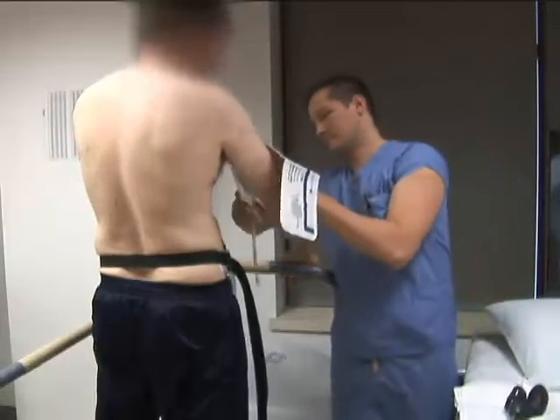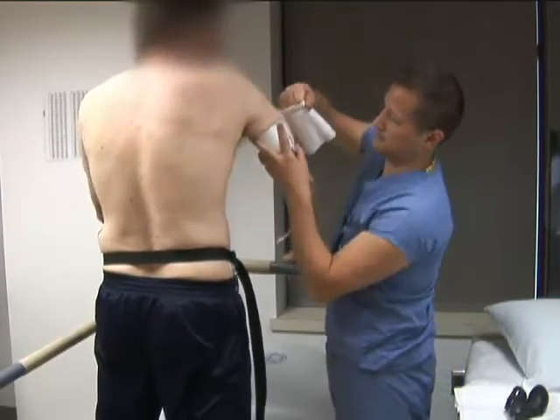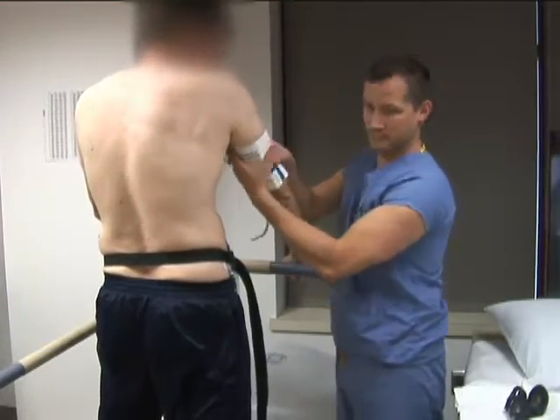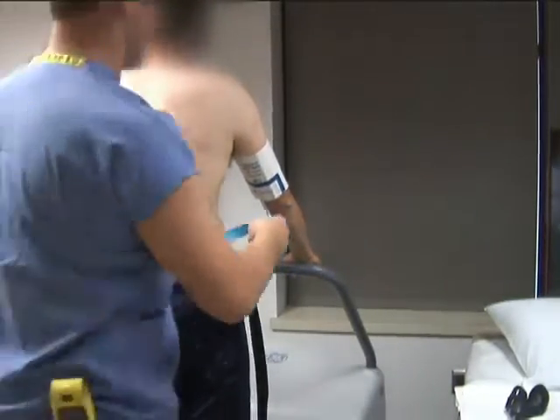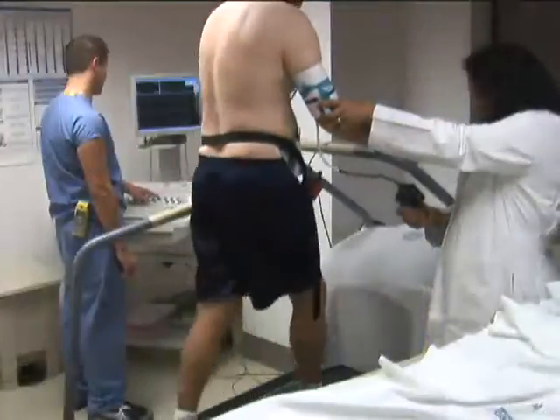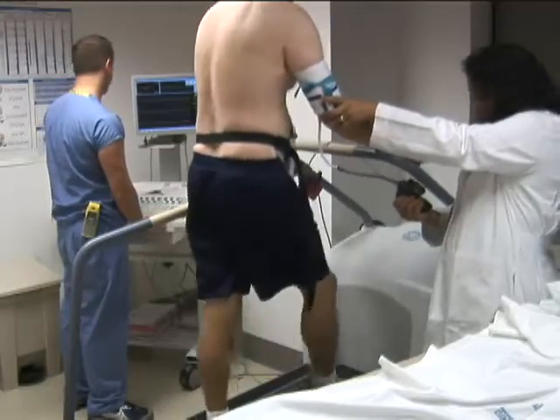There are several exercise protocols used in clinical practice. We typically use the Bruce protocol, which is programmed to increase both in incline and speed in 3-minute stages. Blood pressure and heart rate are recorded at baseline and during the last minute of each stage. Periodically, the patient is asked if they are experiencing anginal symptoms.